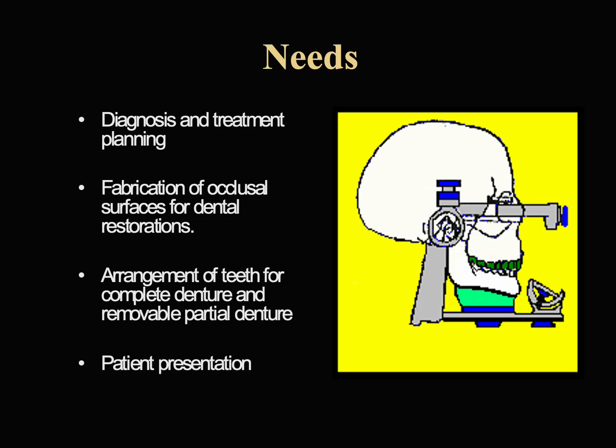An articulator is used for diagnosis and treatment planning, for fabrication of occlusal surfaces for dental restorations, for arrangement of teeth in complete dentures and partial dentures, and it can also be used for patient education.